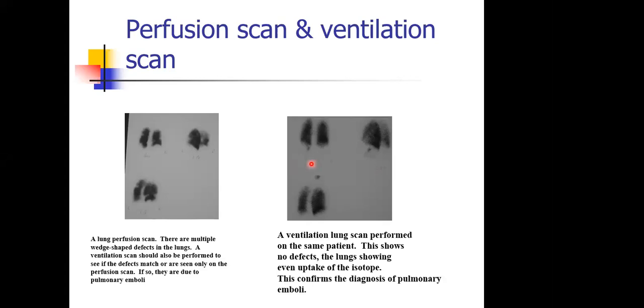As the patient breathes in and out during the process of nebulization, the radioisotope settles down in the alveolar spaces. Once it is settled there, it begins to emit gamma radiation, which is again imaged so that we have ventilation images like we are seeing there.